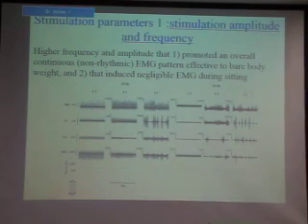So briefly, how did we pick those stimulation parameters? One important point, the link between frequency and amplitude, as we previously saw, is that if you use an amplitude that is too high with higher frequencies, then you start driving intermittent rhythmic activity that is not good for standing. So, talking about amplitude and frequency, we try to modulate them synergistically so that we achieve a continuous pattern with a relatively high frequency at a stimulation amplitude that doesn't actually drive this rhythmic activity.